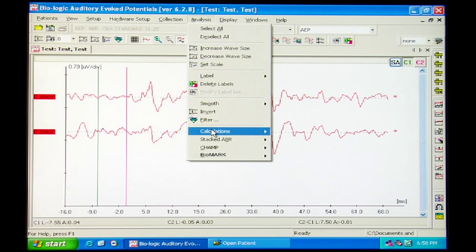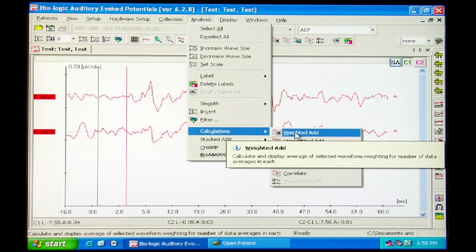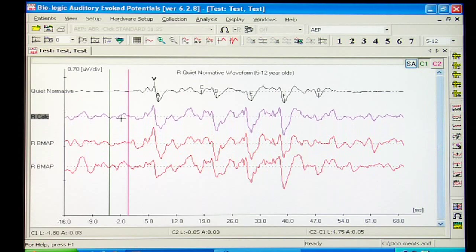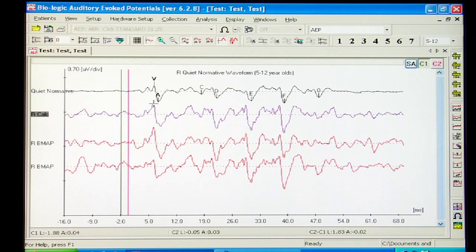The first step is to average together the two trials. The next step is to mark two peaks on this new, final Biomark waveform.